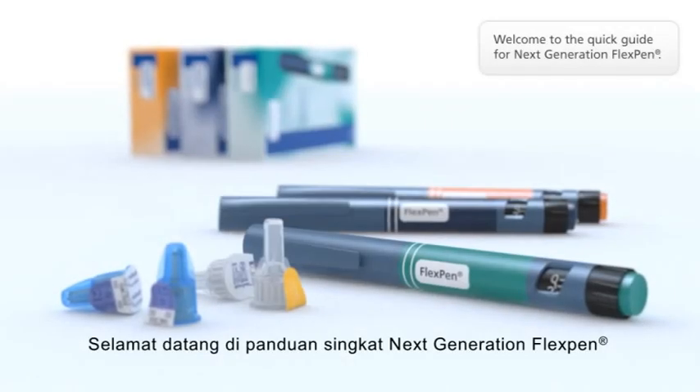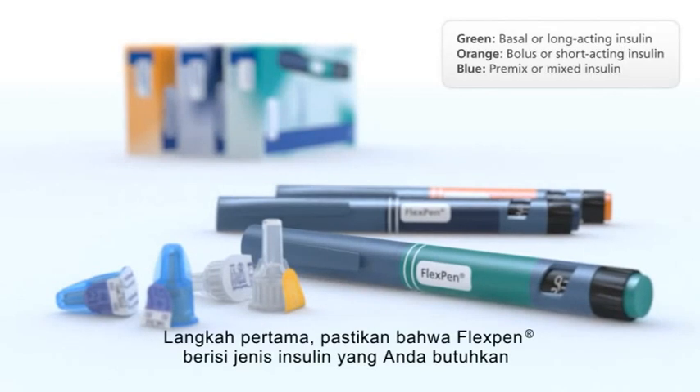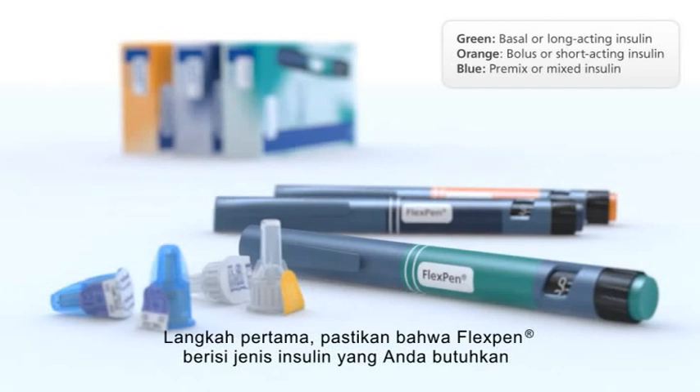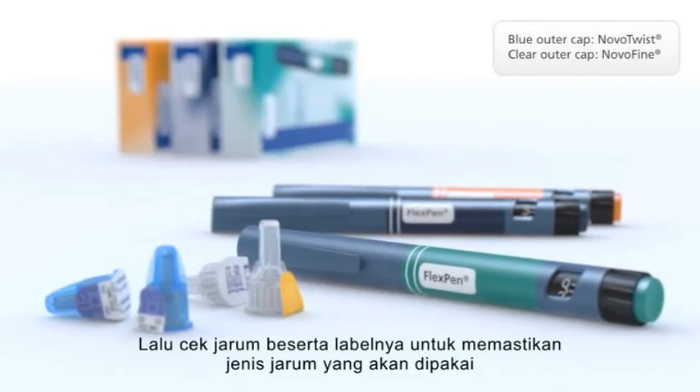Welcome to the quick guide for Next Generation FlexPen. Start with checking the pen label to be sure that FlexPen contains the type of insulin you need. Then check the needle cap and paper tab to identify which needle you're using.